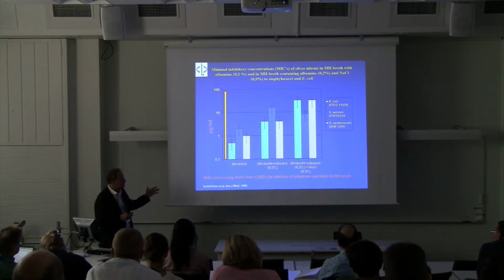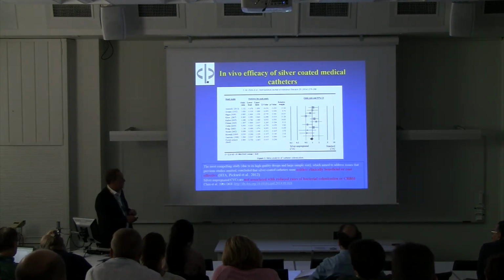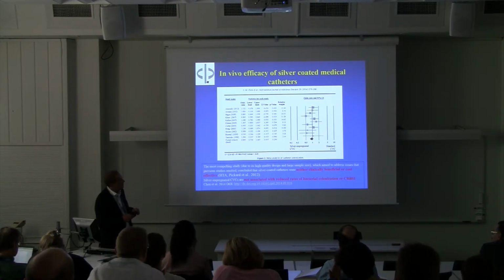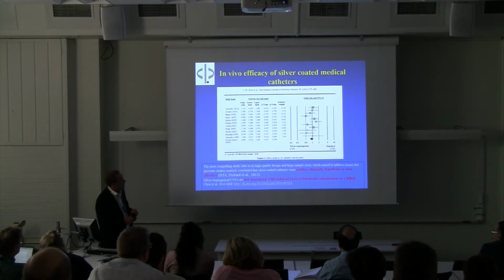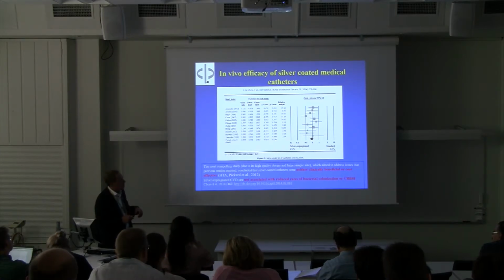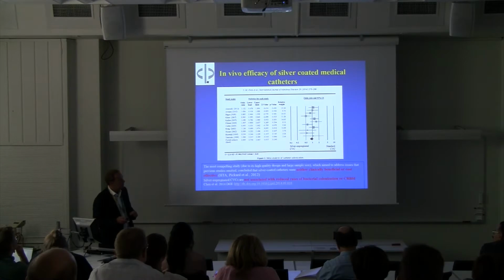If you are getting some in vitro data of new silver devices, which are very nice, they have always been done in broth, never with albumin or chloride. And therefore, the meta-analysis, the health technology assessments and reviews in general for silver-coated devices are not positive. You see a lot of studies have been done, so positive studies which have been done, for instance, by Boswald nearly 20 years ago, where there's a very low number of patients, and the studies with negative outcome have been done with big patient cohorts, and therefore there's no recommendation for using silver-coated catheters, unfortunately.